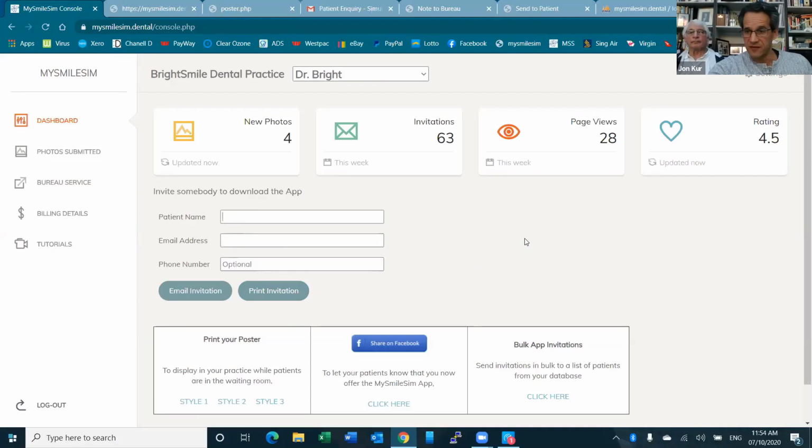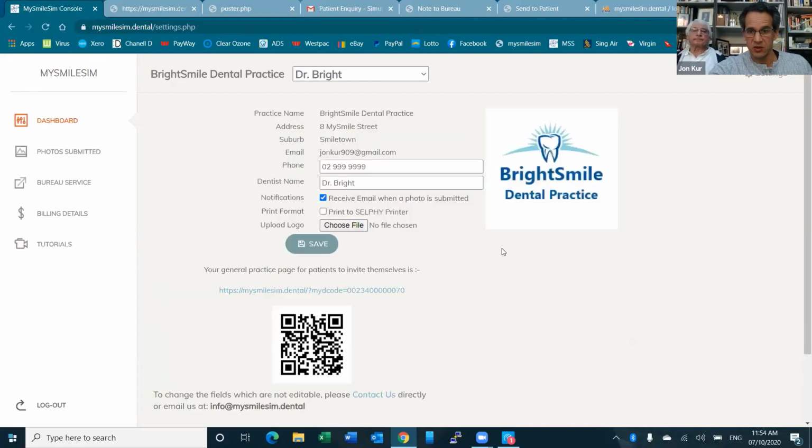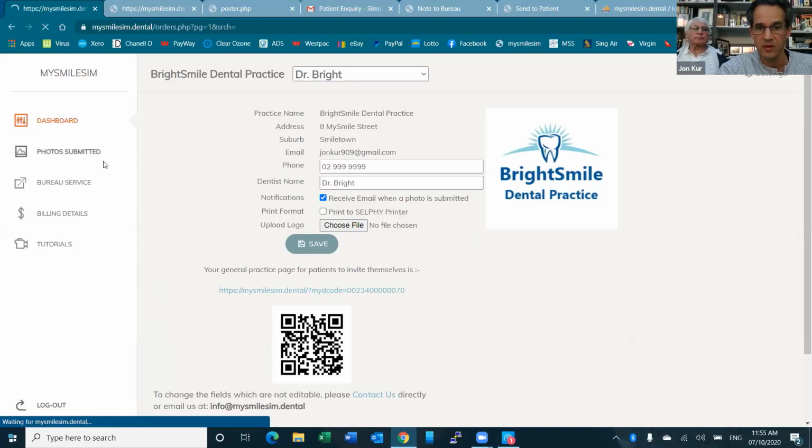So I've sent myself an invitation from this practice, which is called Bright Smile Dental Practice. And then I'm going to, in the app, take my photo. Okay, and use it. So in the background, the system checks every minute to see if there's been a new photo submitted. So within a minute, there should be the notification coming through.